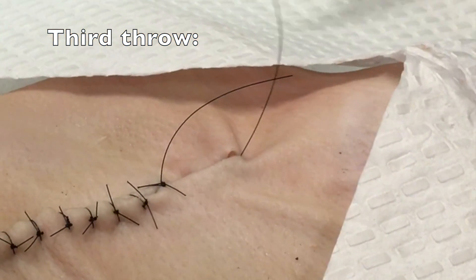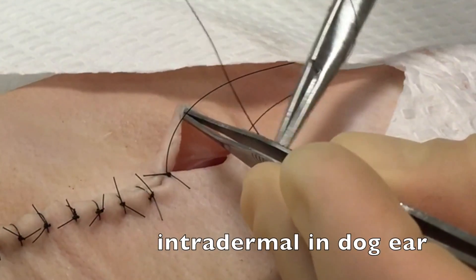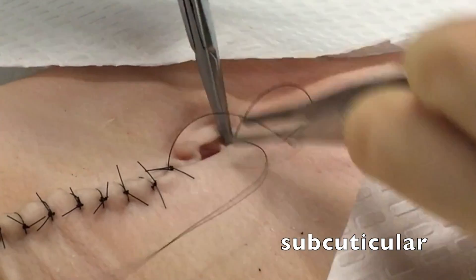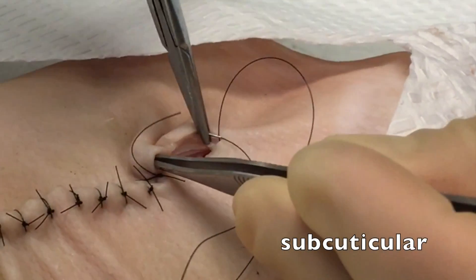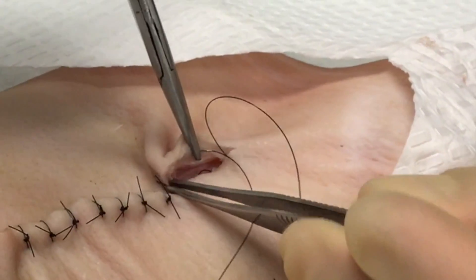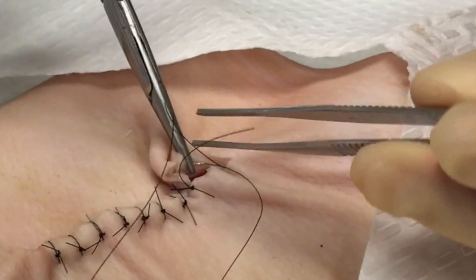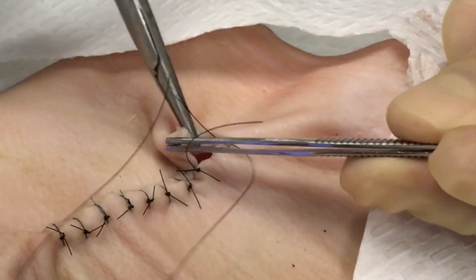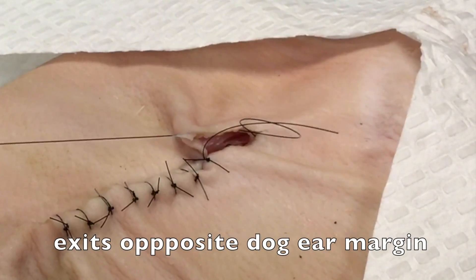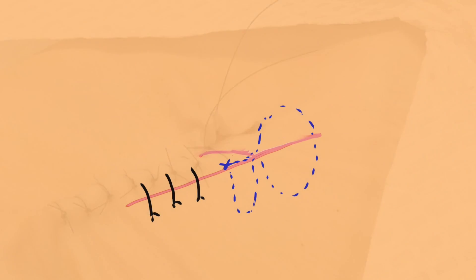This throw will go through the margin of the dog ear, starting at the apex, going intradermally in a subcuticular fashion. Pickups can be used to help guide the suture through the tissue. You'll run that suture through the intradermal layer and exit opposite the dog ear margin, basically back where you started your first throw.